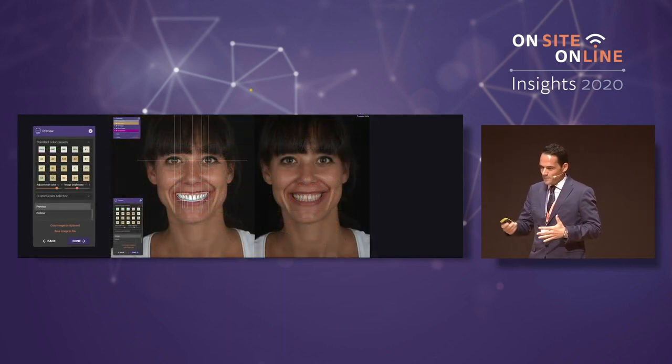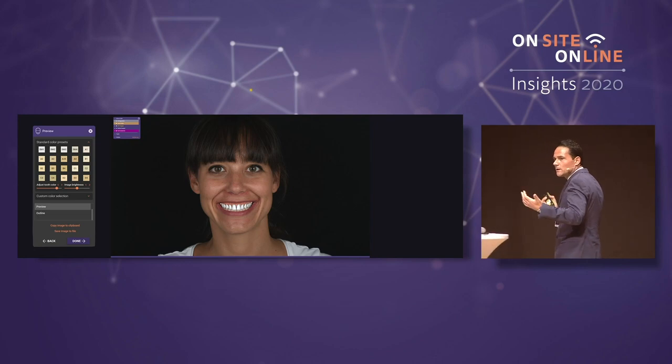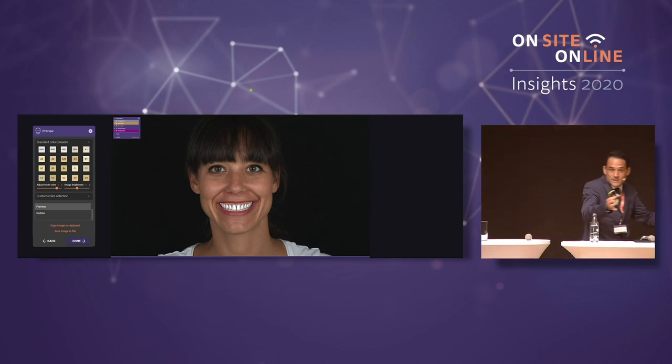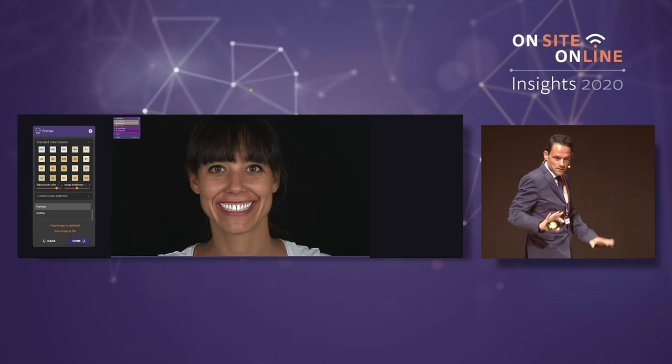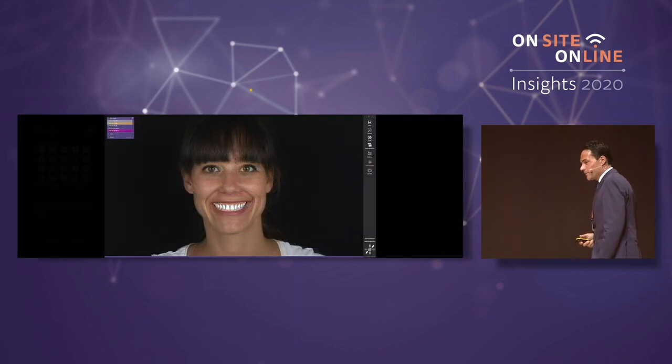I can change the color. I like to use white teeth because all my patients want white teeth. So I never use A3, A4, no, all just white, and you are going to be always in the correct decision. So send to the patient white teeth, and they will say, yes, I want this teeth in my treatment.